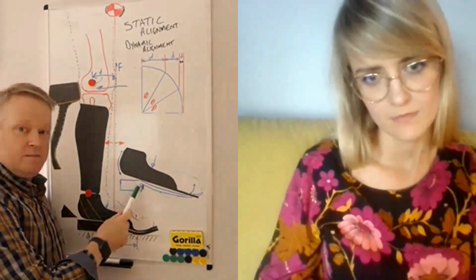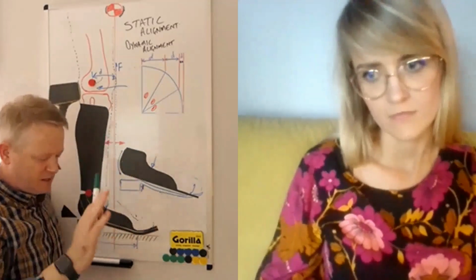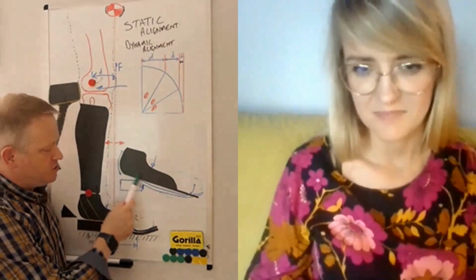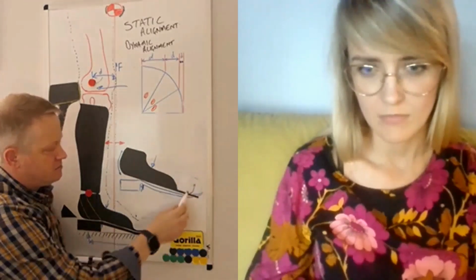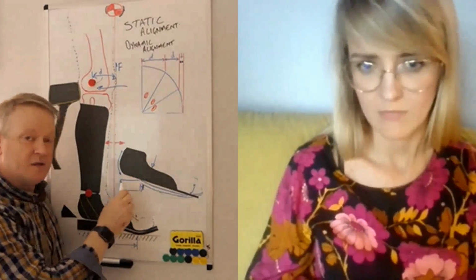A flat foot plate, in my humble opinion, like this one, could also cause significant issues with tone. I don't do these, and I shudder when I see them, because you see this 90-degree AFO has now been put into a shoe. This bends up and down. This rocks back and forward, causing instability, confidence issues. It can cause major tone issues.